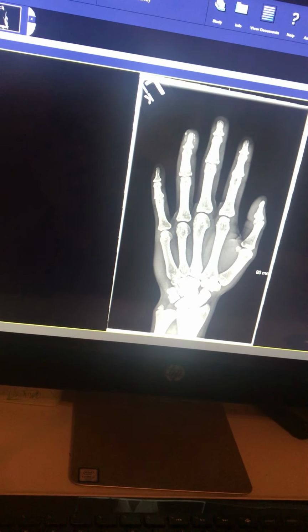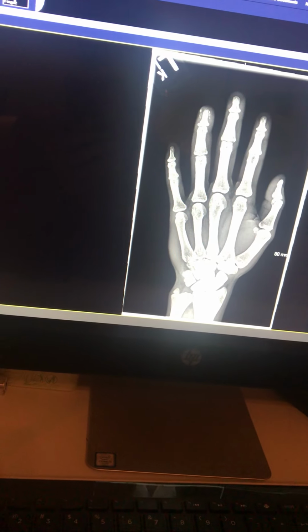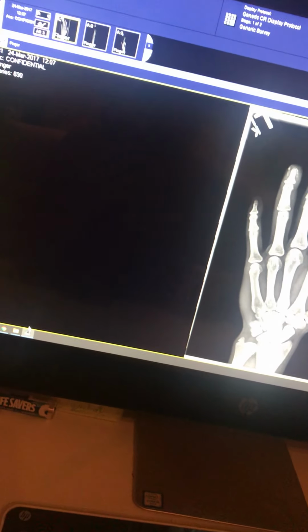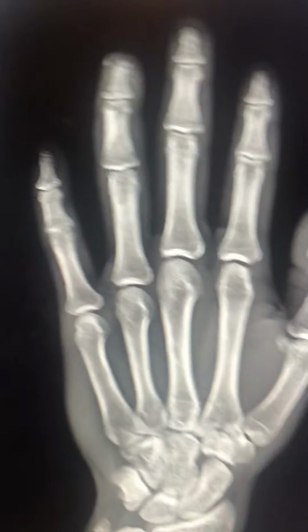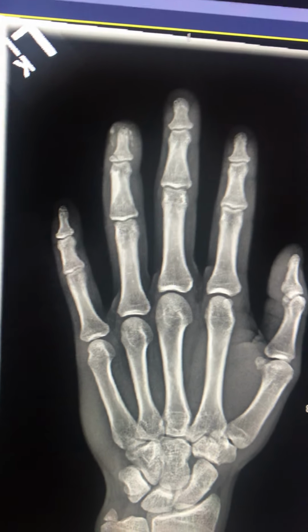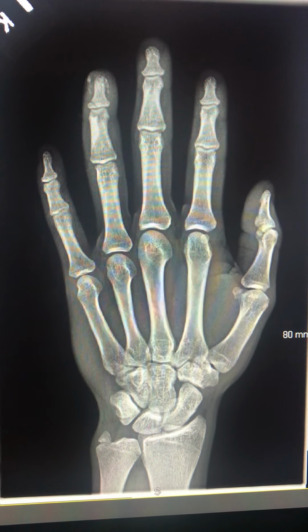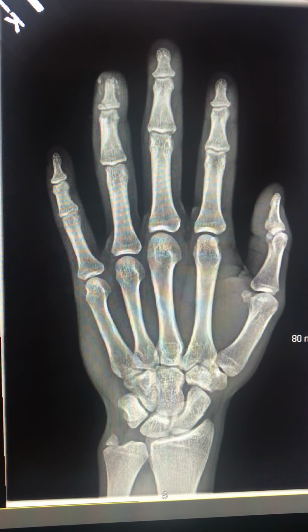The patient was able to walk into the department and was seated in a chair at the end of the X-ray table. The IR was placed tabletop. So I'll get close now. This is the PA hand projection. The hand was placed pronated in the middle of the IR.